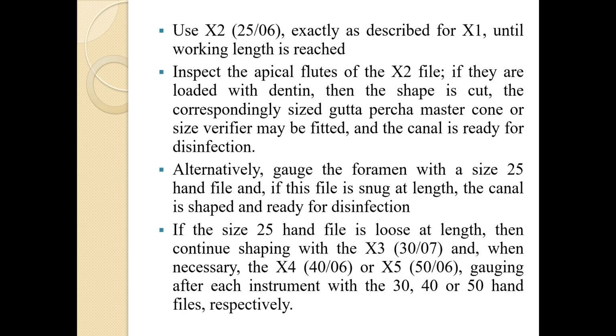Use X2 exactly as described for X1 until working length is reached. Inspect the apical flutes of the X2 file. If they are loaded with dentin, then the shape is complete. The correspondingly sized gutta-percha master cone or size verifier may be fitted and the canal is ready for disinfection.